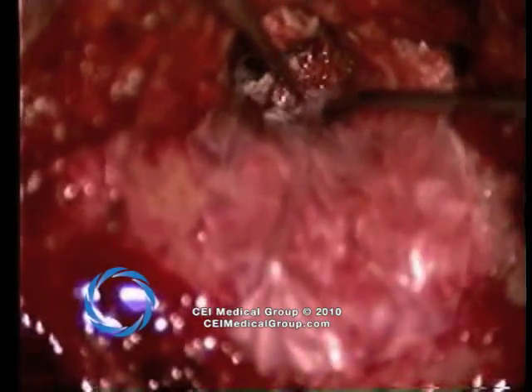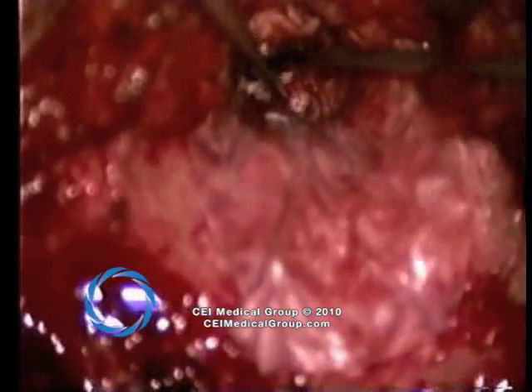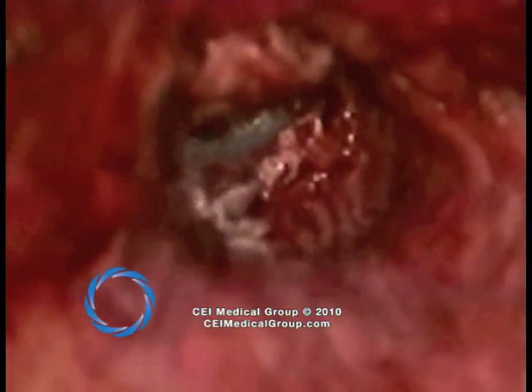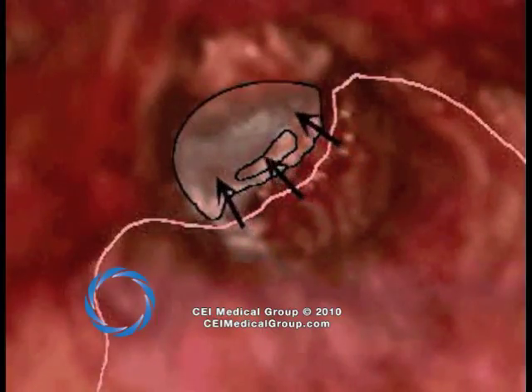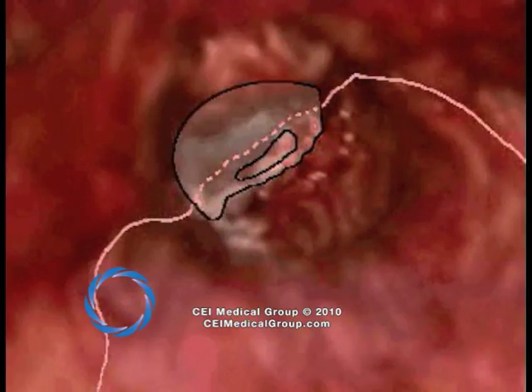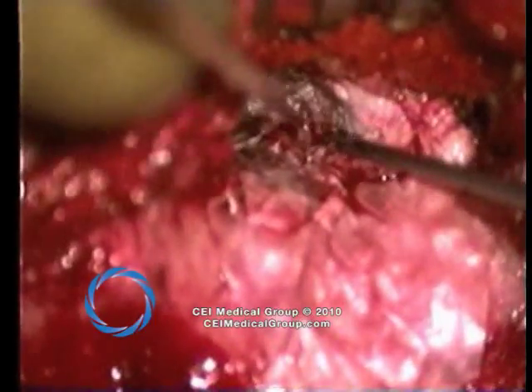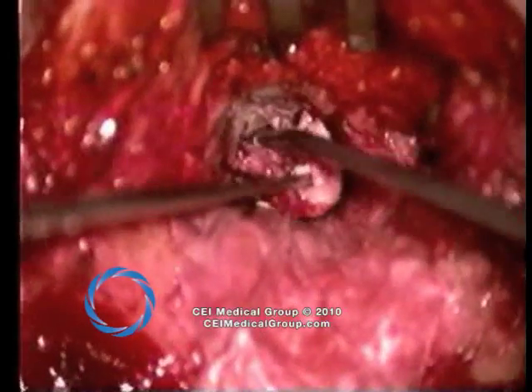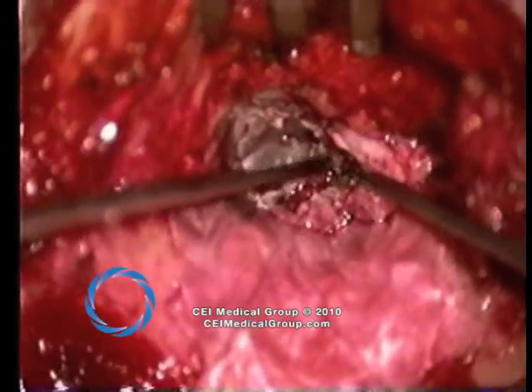The surgeon should conceptualize a middle ear space completely separated from the bone pate by fascia. Here is a schematic showing the remnant tympanic membrane with the fascia being brought in to cover the pate and being placed as a medial graft under the remnant tympanic membrane. The progression in the schematic reemphasizes the point that fascia should contact the facial nerve ridge posteriorly and superiorly. The tympanic membrane is smoothed over the top of the fascia, and then the previously created flaps are unfurled and placed directly over the fascia. The flaps are inspected and areas of under-folding prevented.